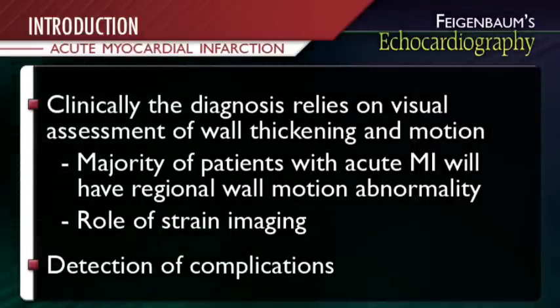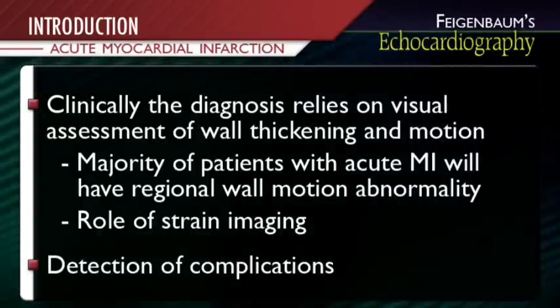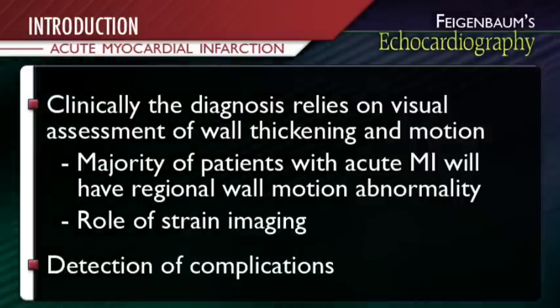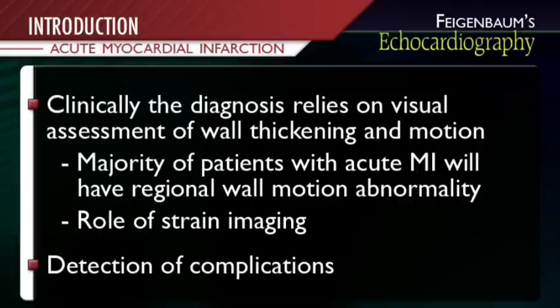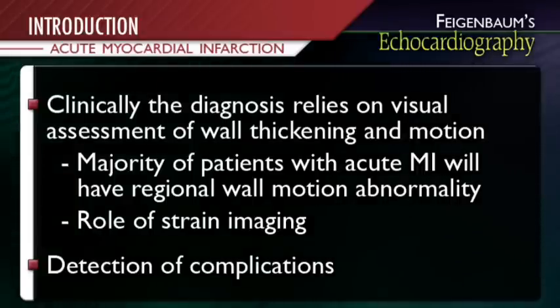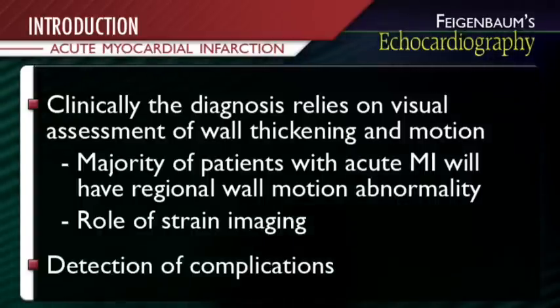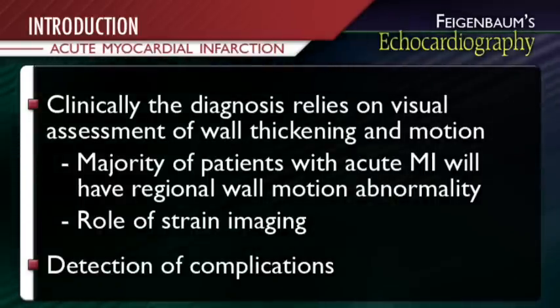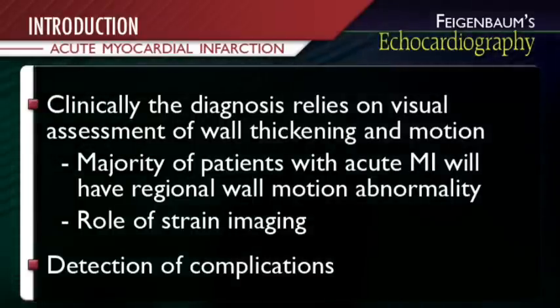It can be used to help establish the diagnosis when a regional wall motion abnormality is identified. The majority of clinical decision-making is based on visual analysis of regional wall motion. Development of a regional wall motion abnormality requires involvement of a critical mass of myocardium. Myocardial infarction below that threshold, as can be documented by sensitive enzymatic assays such as troponin, may not be associated with visible wall motion abnormalities.